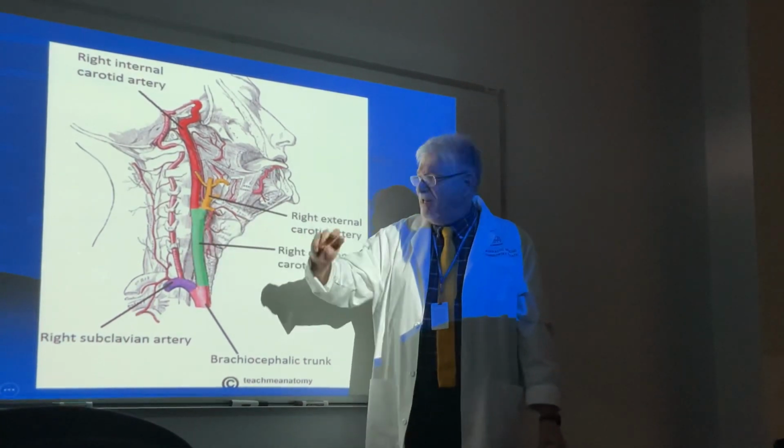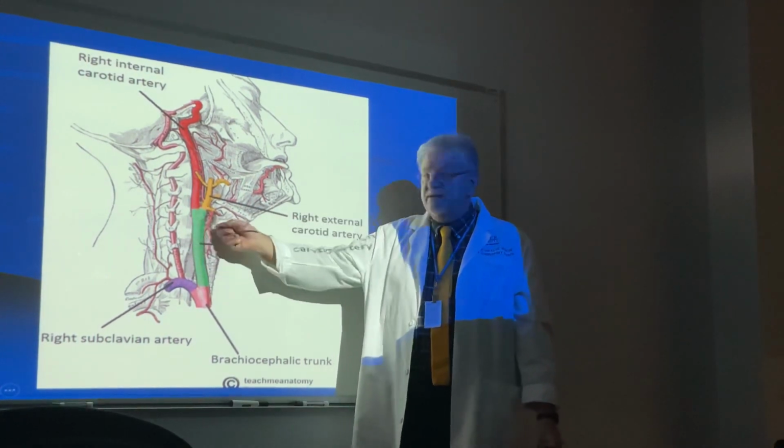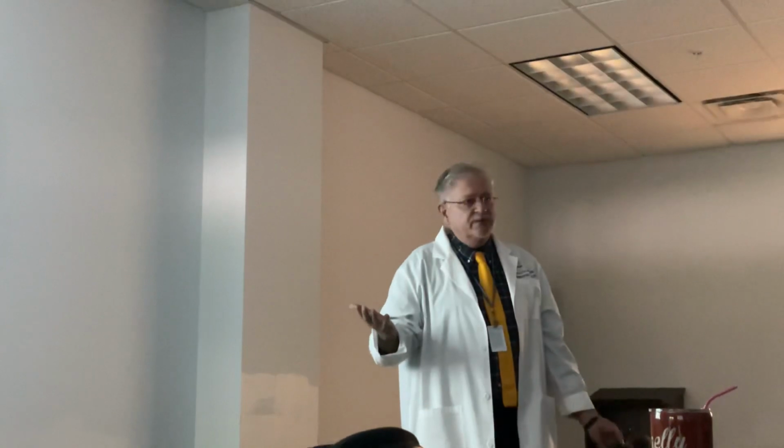But it's also understanding that this is anatomically in the transverse process region, this is in the anterior soft tissues, because when you look at your x-ray, you have to know where the two regions are. Now, why do you think I'm telling you that? Do I see it a lot, not see it, or what's the other only option?